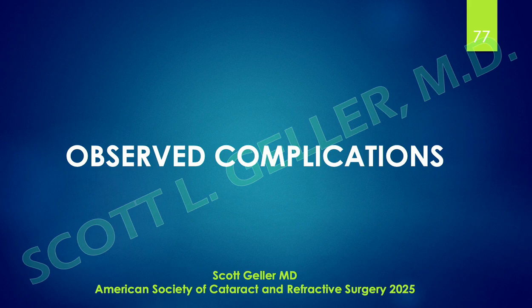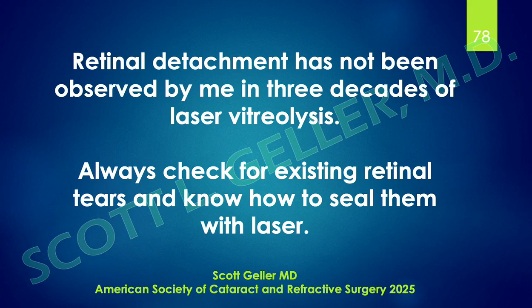So, what complications have I observed? Contrary to what you have been told by your chief of ophthalmology in your residency or other ophthalmologists, retinal detachment is not an issue. It certainly has not been an issue in my practice. I've done over 25,000 laser sessions and have never seen a retinal detachment.